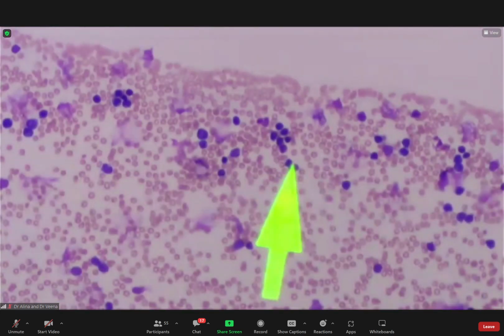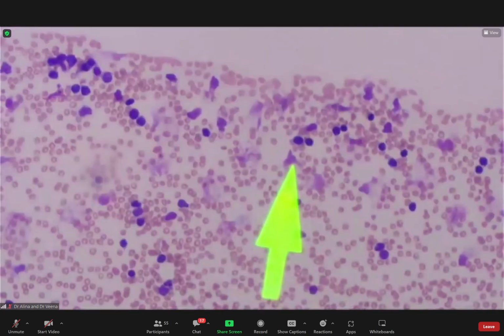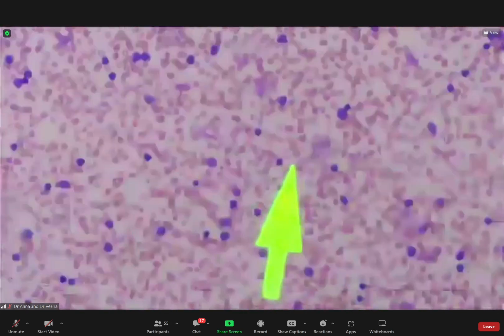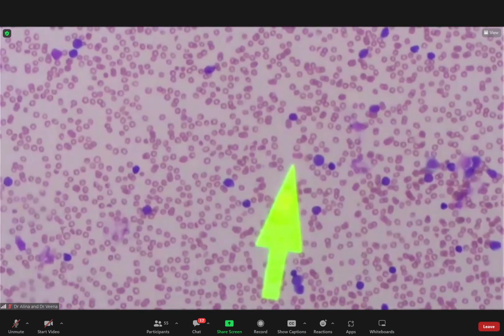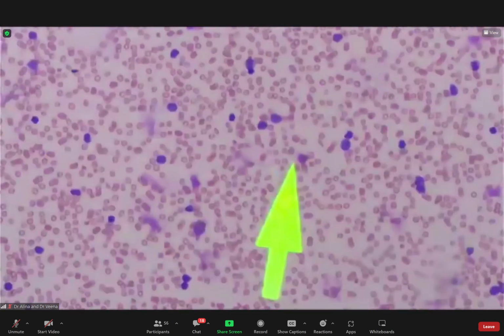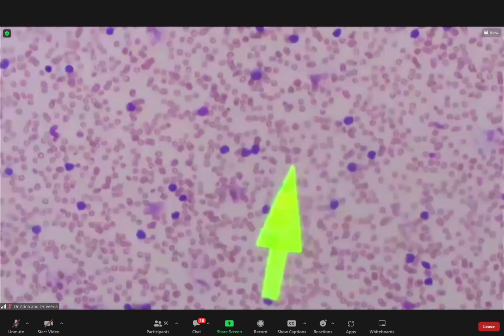So here, you obviously have a very high white cell count. And they are all mainly, what are they? Okay, I have some of you answered lymphoid cells, abnormal lymphoid cells. You didn't want to commit. You didn't want to actually say these are blasts.